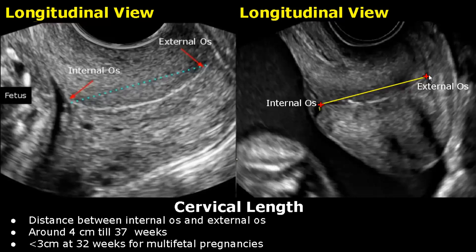The normal cervical length is around 4 cm till 37 weeks gestation. In twin pregnancies, it can be around 3 cm or less at 32 weeks.